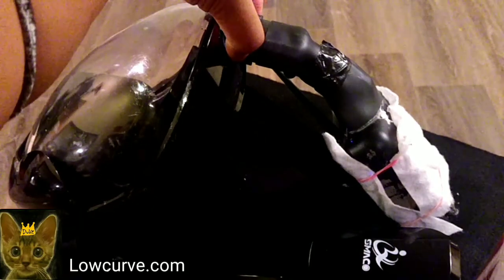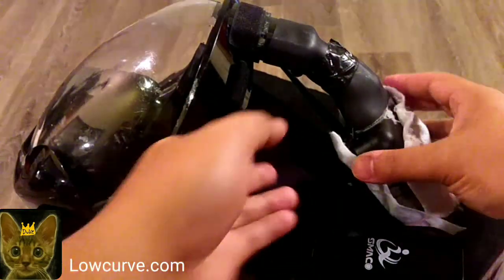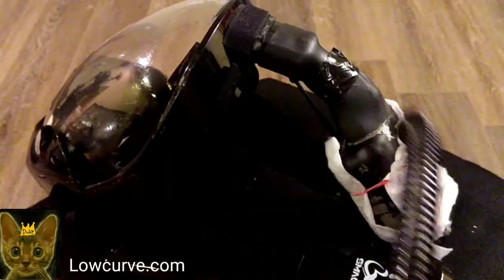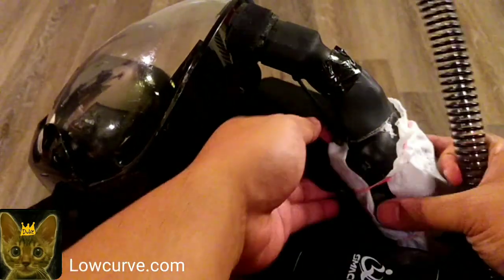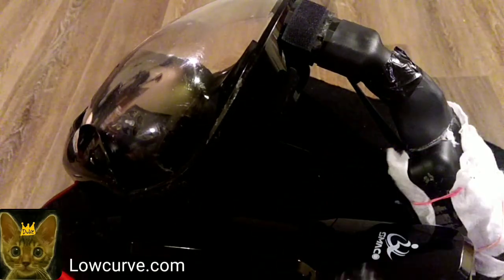Let me explain the way that I did this. First, I clipped the fan to the strap here, and I pulled it as far back as possible. Then I took some of this regular CPAP tubing. In order to make this connection medical grade, so that you don't have to worry about inhaling an unnecessary amount of unknown chemicals, I integrated CPAP tubing. There's a little clip on that fan. You attach it to the strap up there and pull back to get the distance that you need. Then you would cut that off.